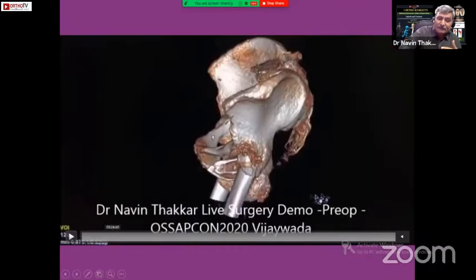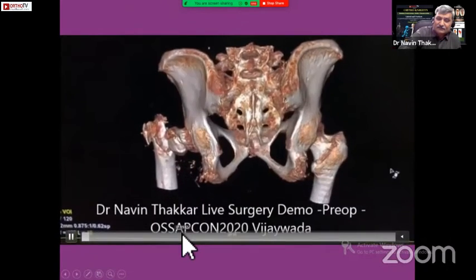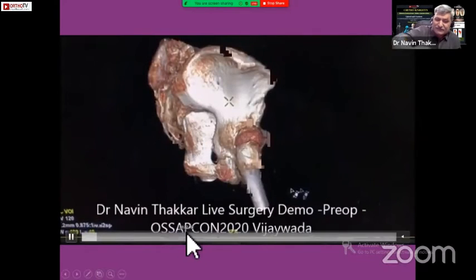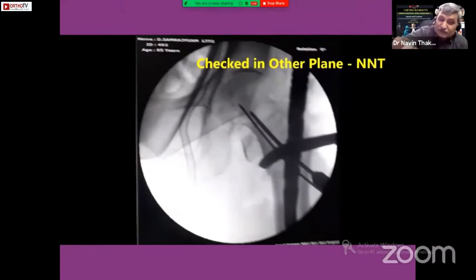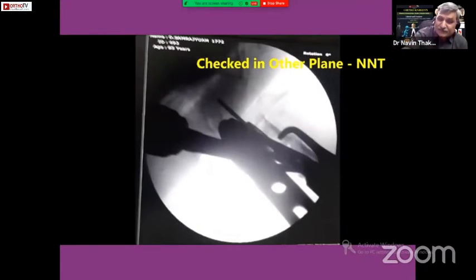Another example, I will not go much. This was a live surgery we had done. Here, it was very much unstable. As G.S. Kulkarni sir has said, the banana fragment and split banana fragment, it was very difficult to reduce. Dr. Tanna sir had observed this because he was moderating from the audience itself. We got the good anteromedial reduction, as you said. It is a must and it has to be maintained continuously, anteromedial reduction.